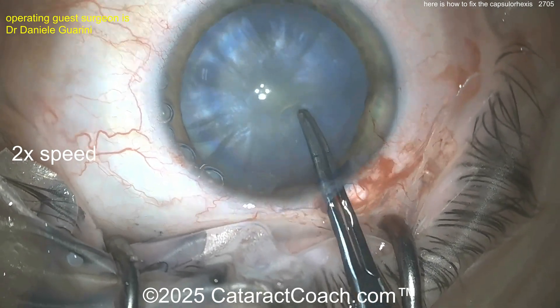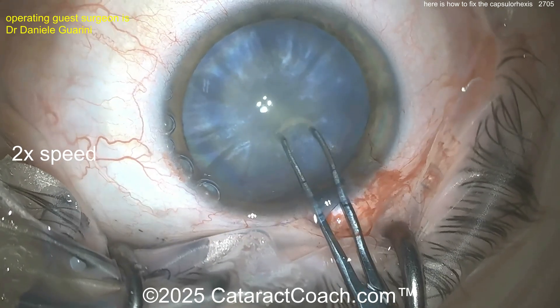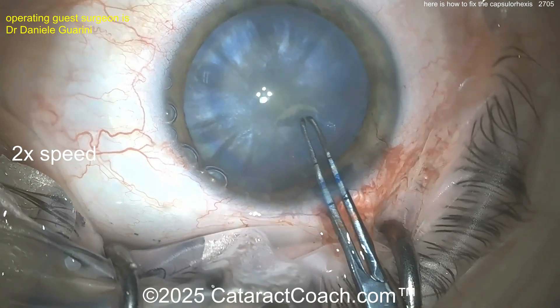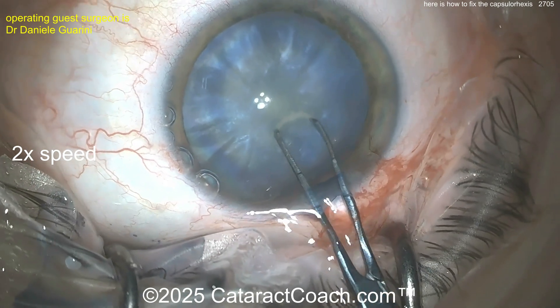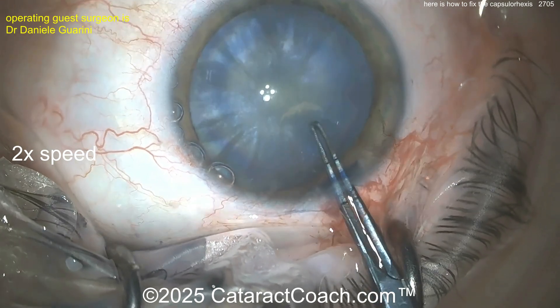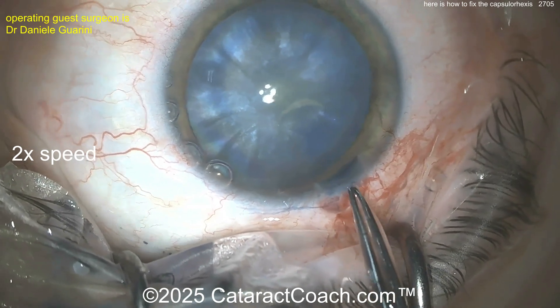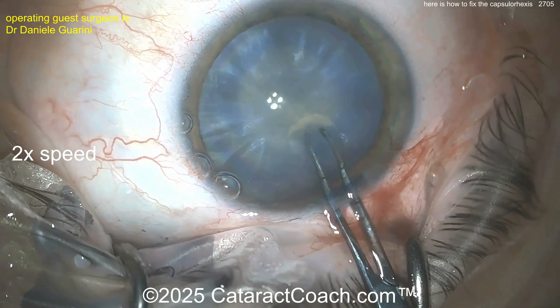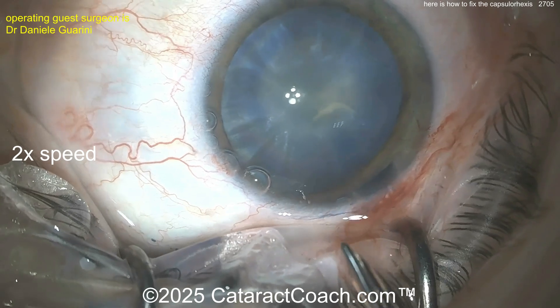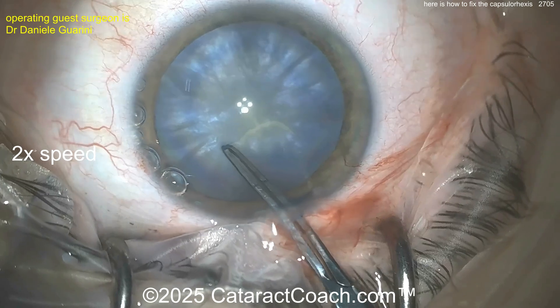The patient may have a hard time looking at the light because of the opacity of the cataract, but grabbing the lens capsule here — that looks pretty good. I don't think there's any posterior forces here that's going to cause it to run out. Try your best to grab. Almost. Try one more time. And almost. Try again. More viscoelastic maybe. Get that flap lifted up somehow. Grab onto that. Look again, taking your time here — you've got no rush. Just do a beautiful job here.